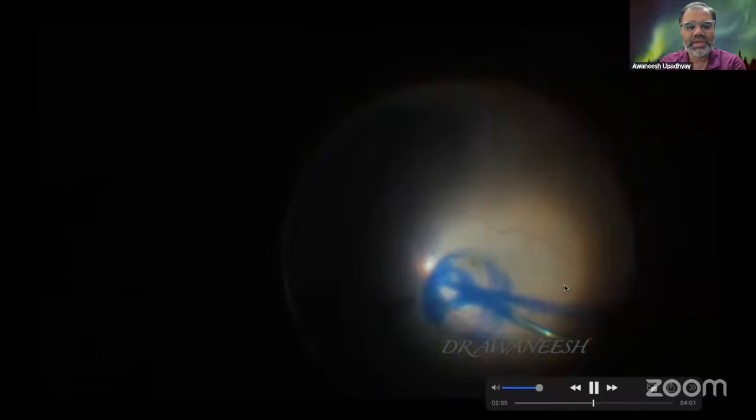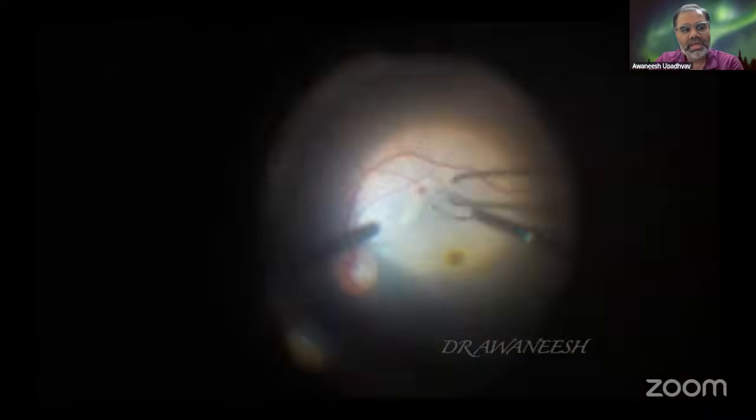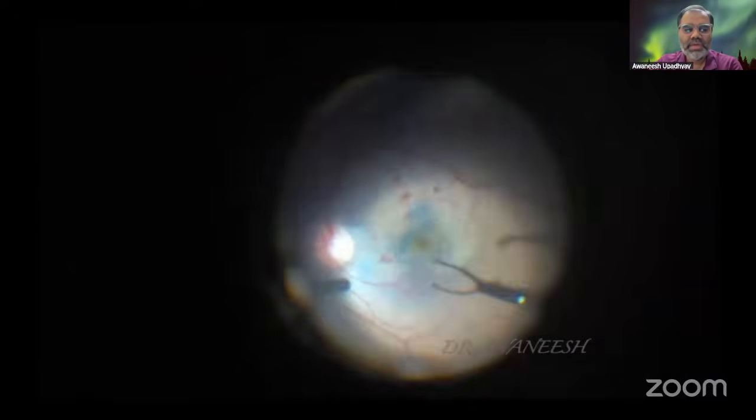One more thing I wanted to emphasize was I have shifted from using a flute for aspiration to cutters in these sort of multi-flap techniques, where I tend to face the cutter away from the fovea, so that will help in not dislodging the graft, and that can also help in scaffolding as well as stabilizing the graft over the hole. So this is my second video, and it is in a similar way, which I'm doing.